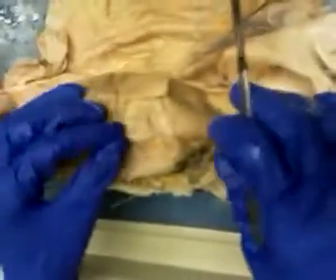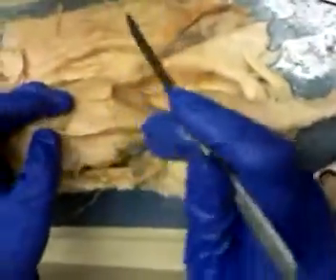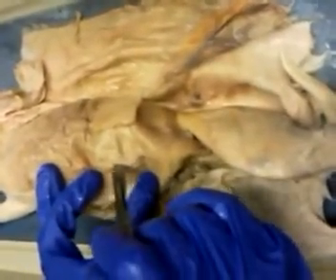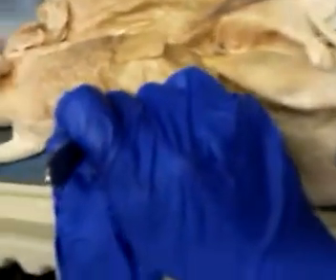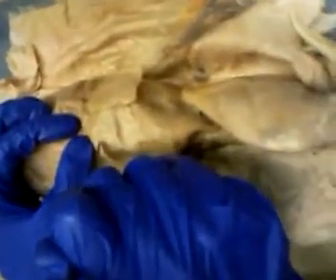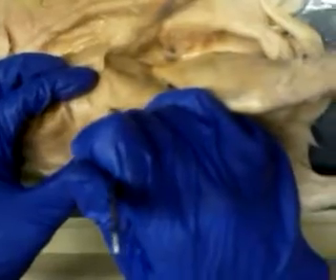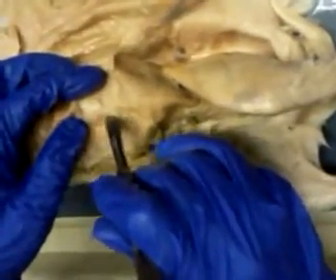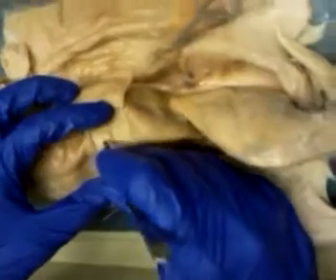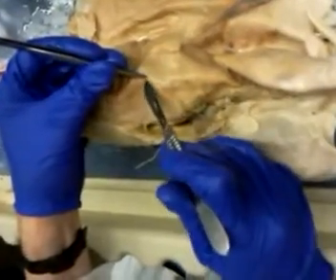No. Unfortunately, there's another layer in here. So let's see, I'll make this a little smaller. An incision right here, and then up. Cutting. My scalpel is dull. I have to see whether I've done anything. Okay. Got a little slice there. Bit of a window.